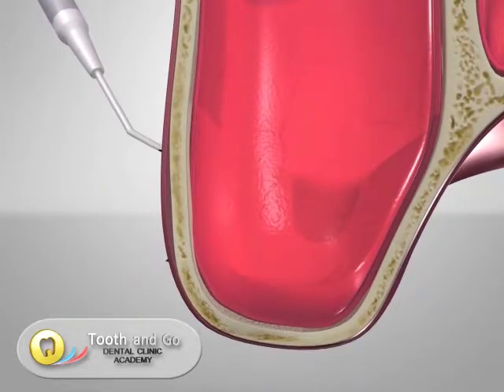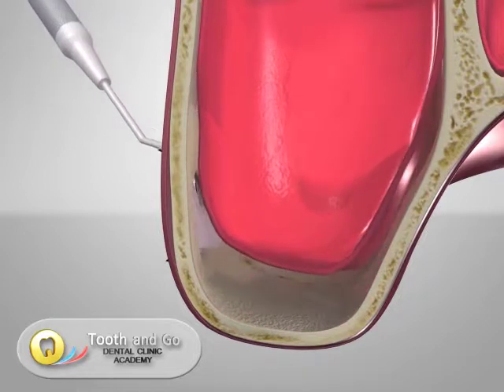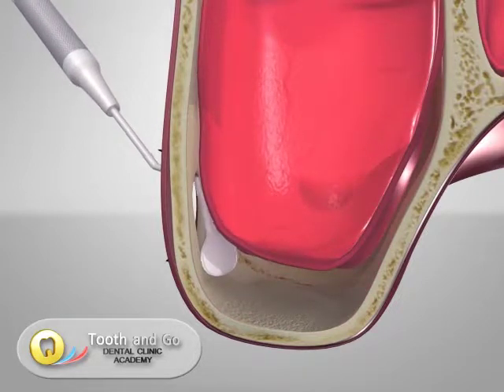A small hole is drilled into the maxillary arch where the bone needs to be augmented. Special tools allow the elevation of the sinus membrane.